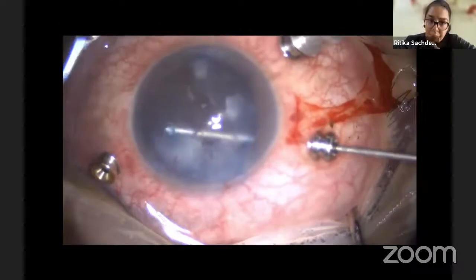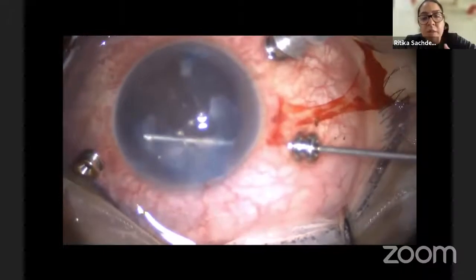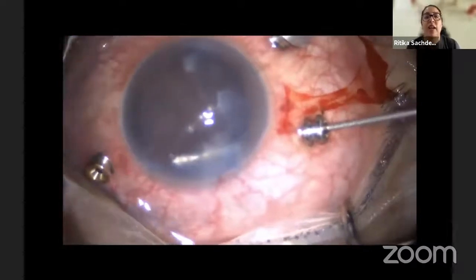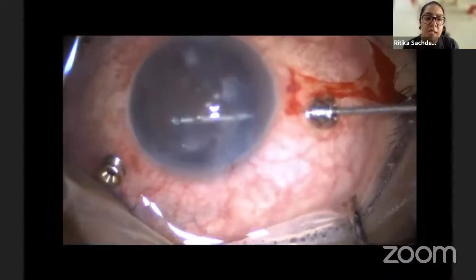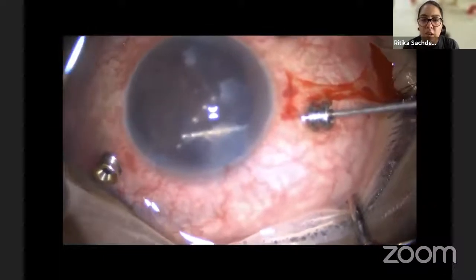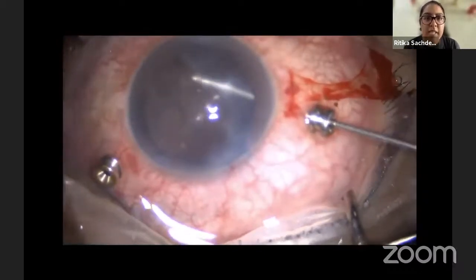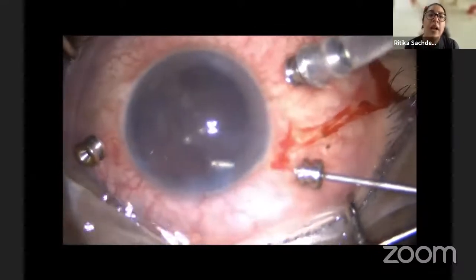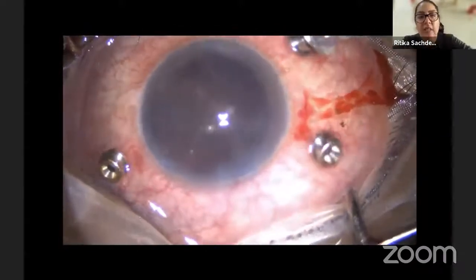Do note that from the cut IA mode, you move to the IA cut mode to aspirate the cortex with a simple yaw on your machines. When you are using a vitrectomy cutter, try and maximize the cut rate and work on medium to low flow parameters. Through this technique, you are getting an effective cortical and vitreous removal, moving from the cut IA to the IA cut mode, depending on whether you're dealing with vitreous or cortex. Do note that an infusion has been placed through the pars plana to keep this globe stable. And because there is now no longer a compartmentalization, you can also have an AC maintainer for the same.